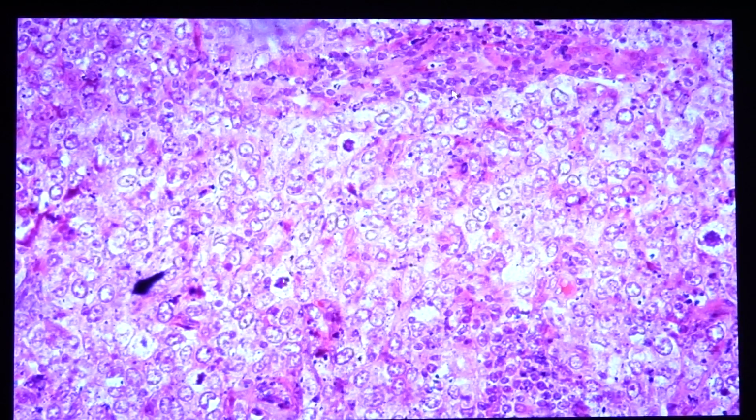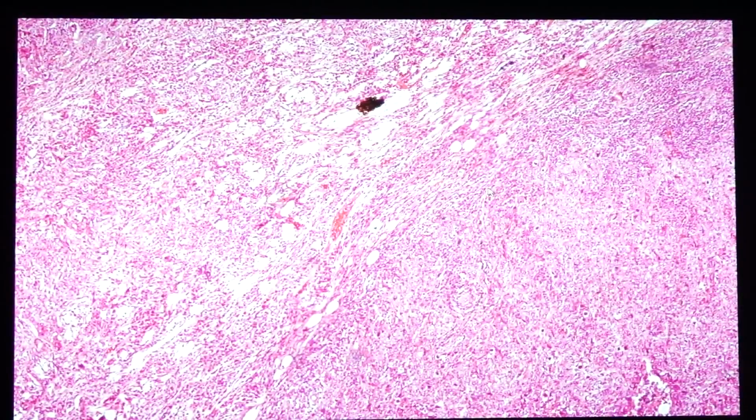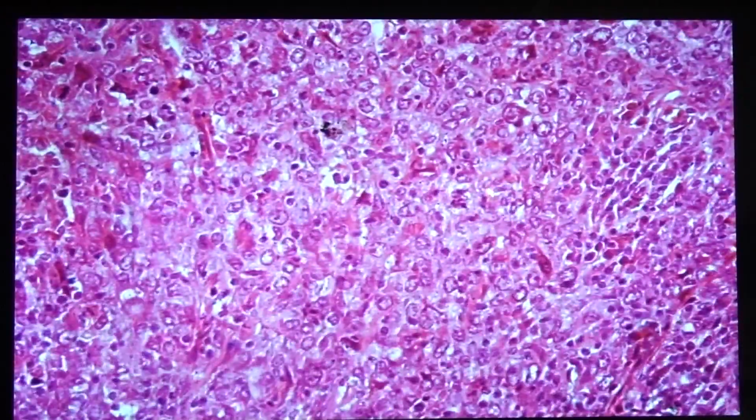And then adjacent to them would be the lymphocytes. So the lymphocytes here would be part of the criteria for diagnosing medullary carcinoma. Without the lymphocytic infiltrates, it's not medullary carcinoma. So this would be called an invasive ductal. Okay, so this is a BRCA1. Usually it is triple negative, and they would be fairly circumscribed. And this would confer a better prognosis than the NOS, or the non-otherwise specified ductal carcinoma.